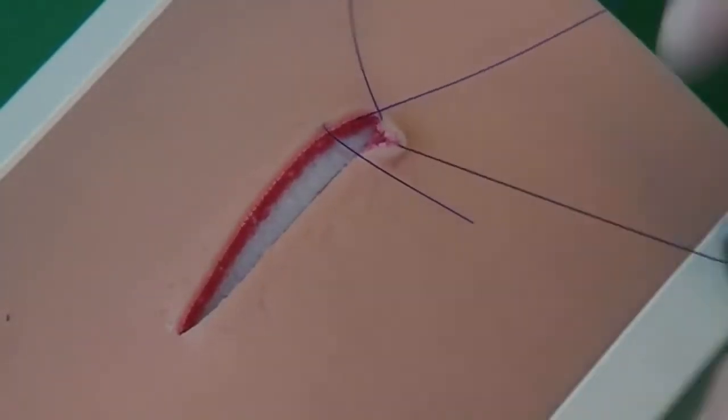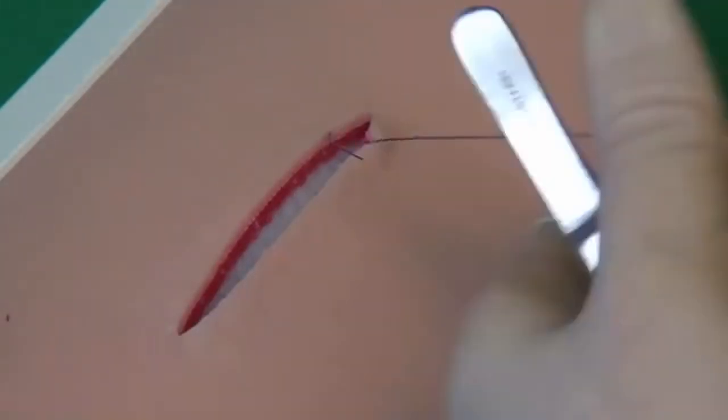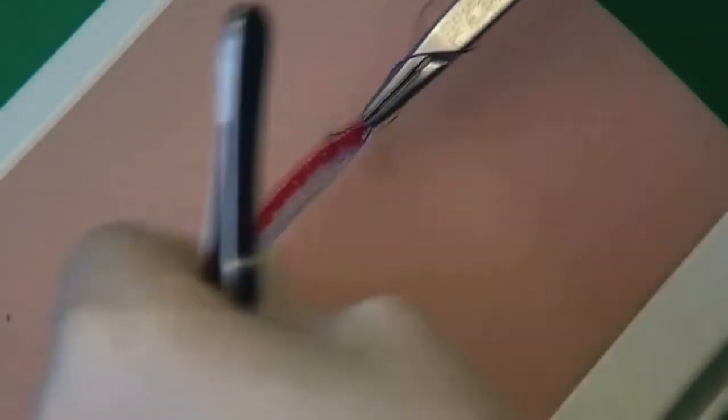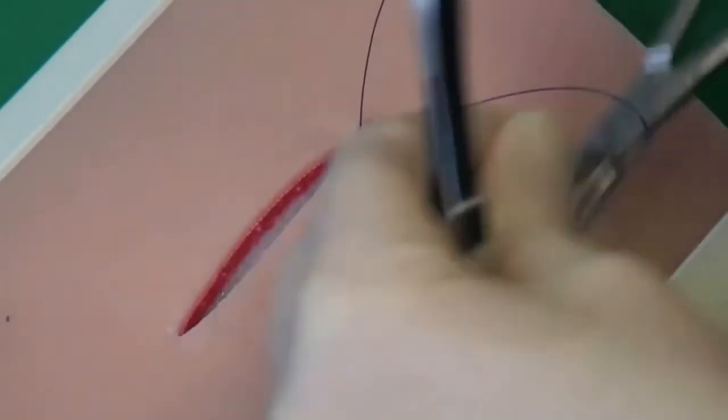The beginning of the suture is tied with a surgical knot. The number of knots depends on the type of thread. When tightening the knot, the thread is pulled in the direction of the incision so that the knot is more easily buried.